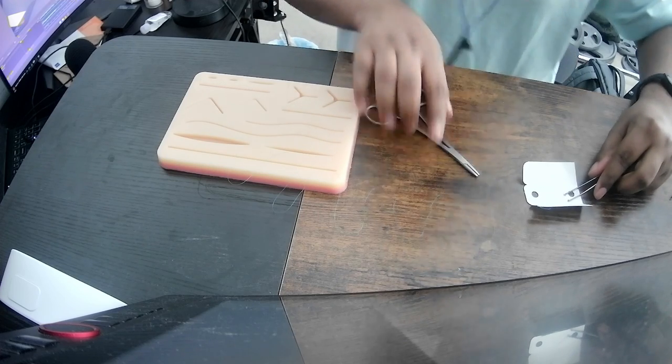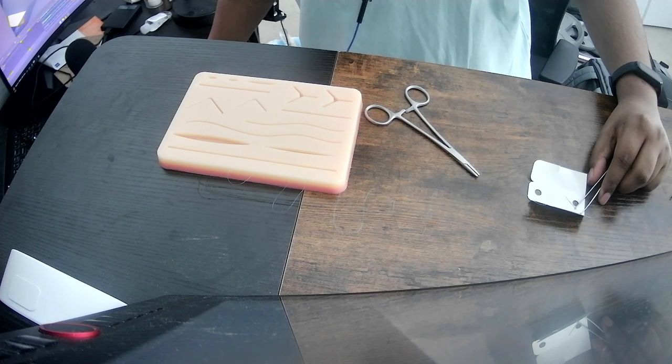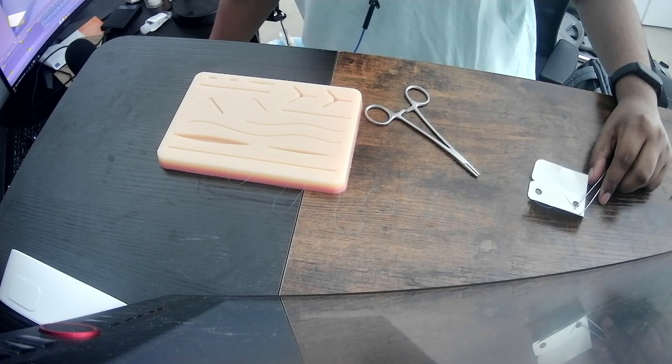Okay, let's finish this video. But you also have the choice of manipulating how you load the needle. It's important in your training now to be very, very aware of your different options. Further back here, for example, a bit through, the embedding of the needle will dictate how much tissue you can drive the needle through, away from you, because of the orientation of the needle.